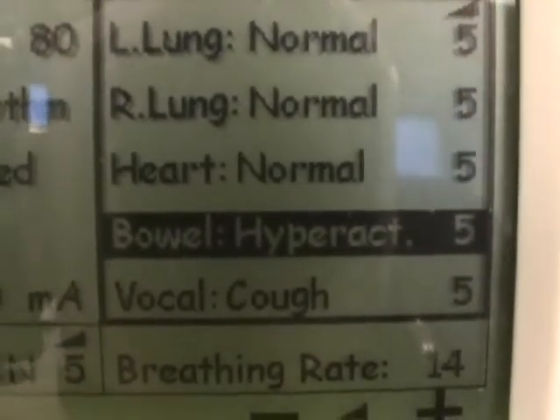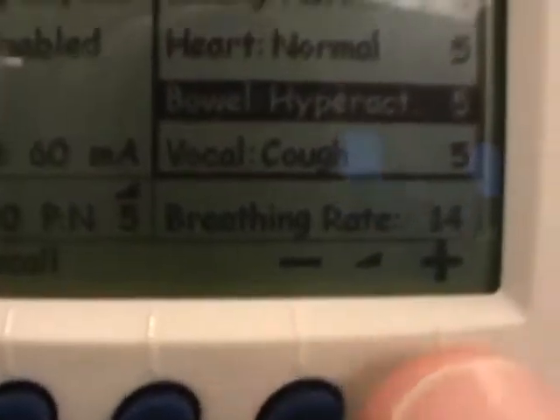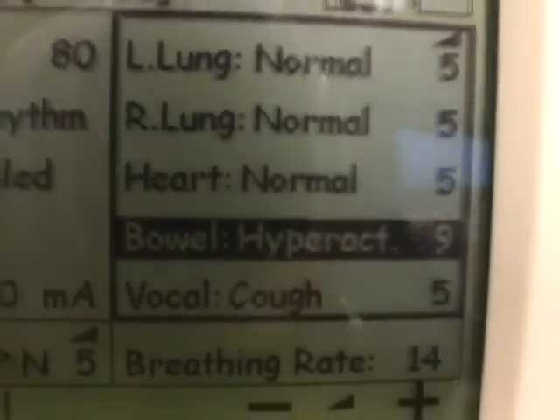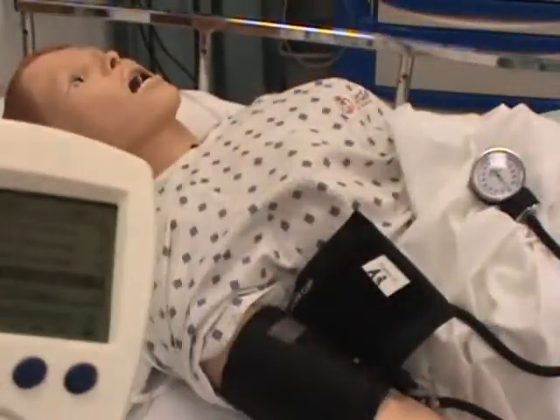Let's say you want to raise the volume. While bowels is highlighted, simply go to the plus and minus arrows and increase or decrease volume as needed. Then let your students use their stethoscopes to landmark and listen for the bowel sounds.